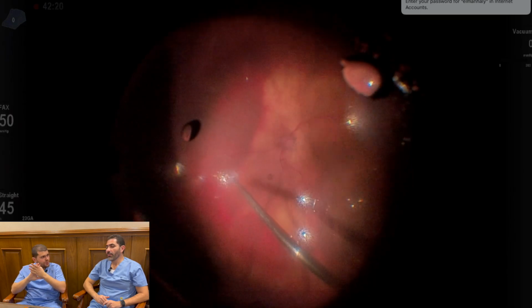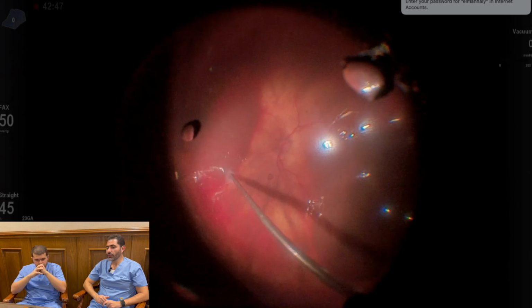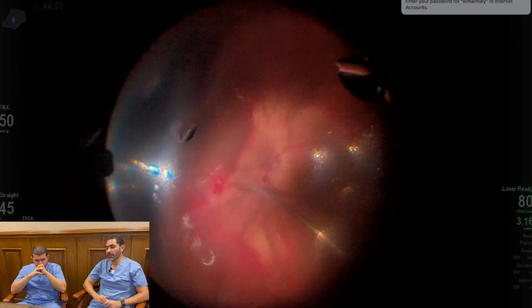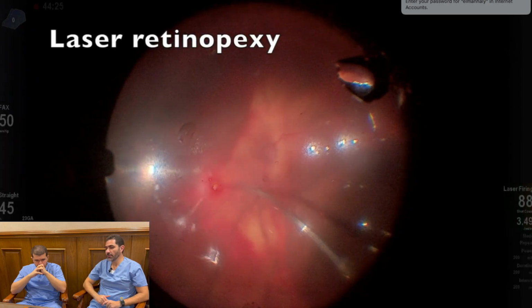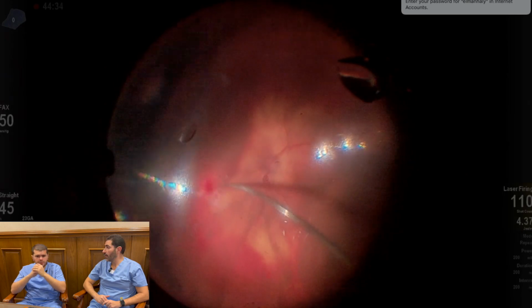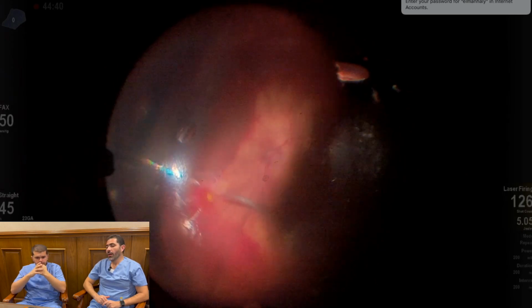You don't regularly do a posterior retinotomy, right? No, I don't like it at all because in my hands it's complicated with some PVR and some traction, and it may be a source for recurrence. So after draining from this... But why retinotomy? Didn't you choose to put PFC and drain from the peripheral break?